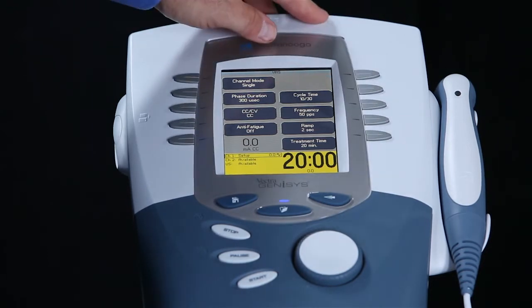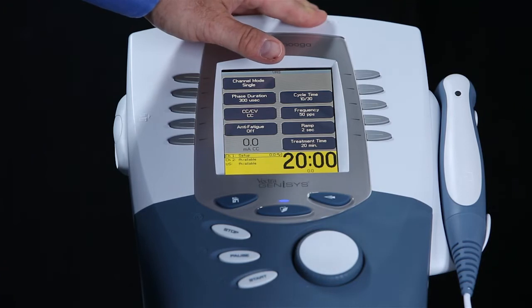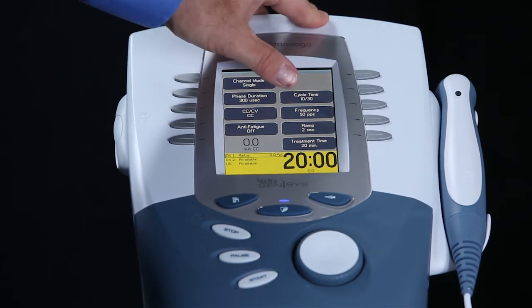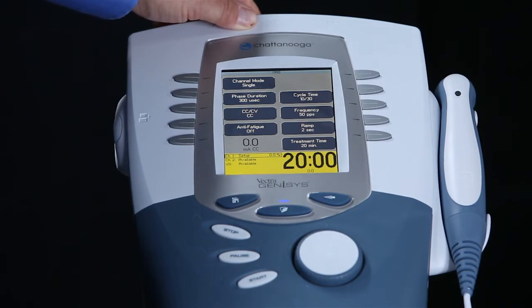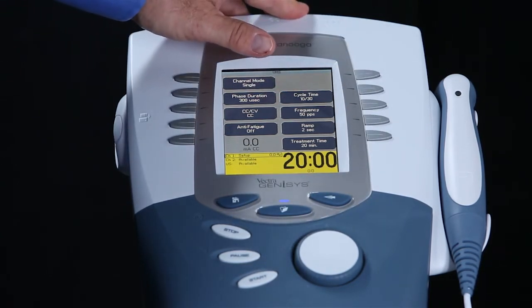The frequency is set at 50 pulses per second. This is so we can recruit fast twitch muscle fiber. Should we wish to recruit slow twitch fiber, we would reduce the frequency to 35 pulses per second. Ramp time is set at 2 seconds. The ramp time is the time it takes the current to go from 0 to its peak. We want the ramp time to be longer as this will be much more comfortable for the patient.